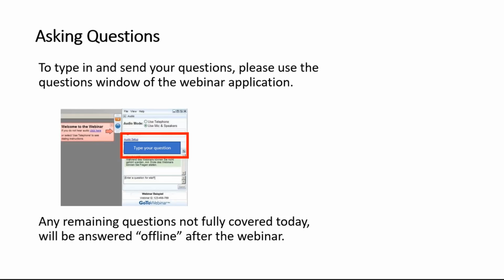interesting. So I have another question here in the window. You mentioned that fluorescein angiography is a very time-consuming procedure. On the other hand, with the en face OCT, do you maybe use more of your, let's say, expert time to interpret the images? So is the approach faster than FA-based treatment? How would you judge that from your daily practice?